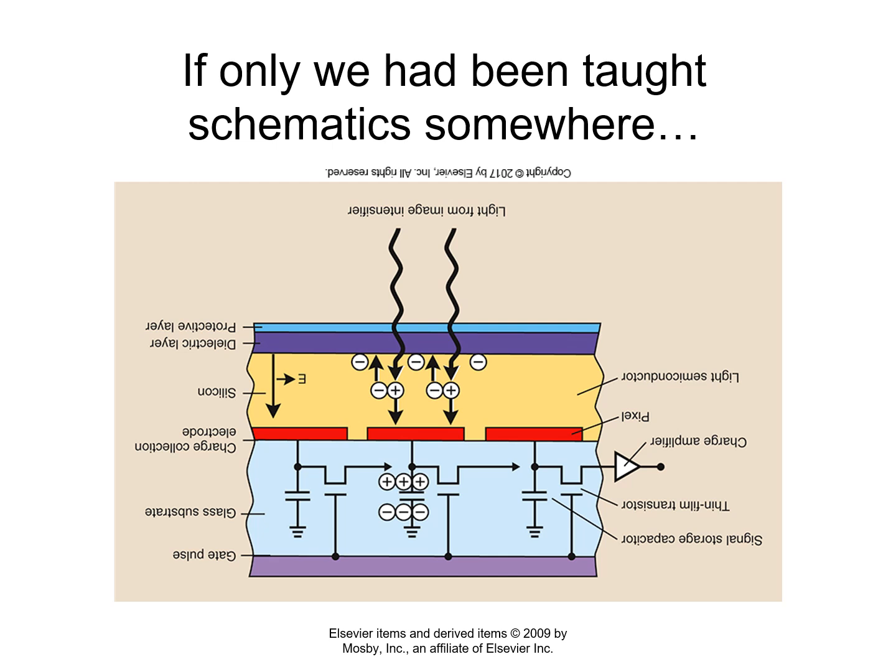Now remember, every positive ion stored is the result of a photon strike. And so more photon strikes means more positive ions are stored, okay? And now to the immediate right of that full capacitor that we see, it looks like a capacitor, but what that actually is, is a transistor. It's a field effect transistor.